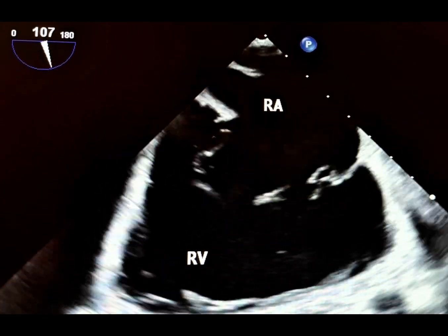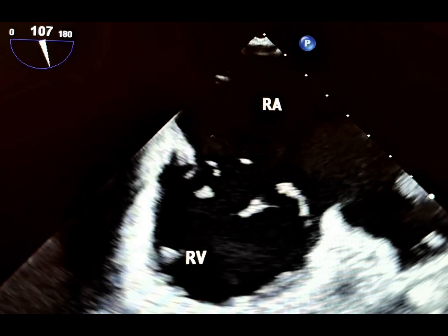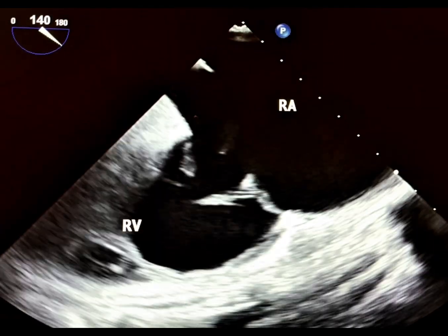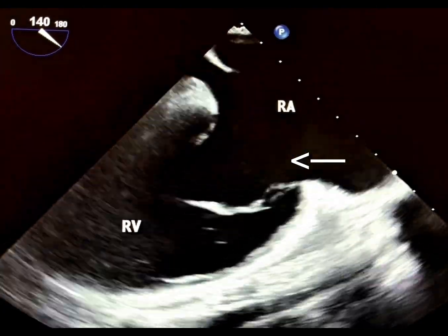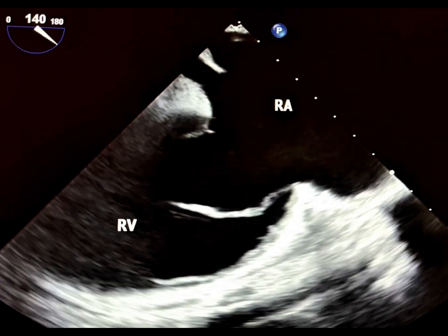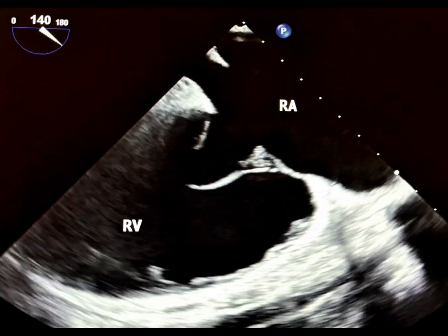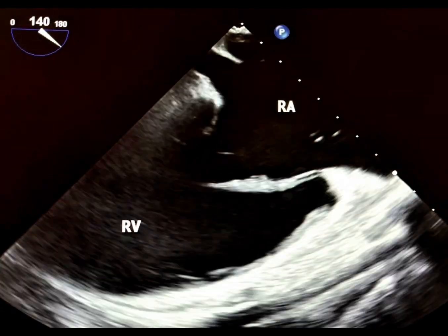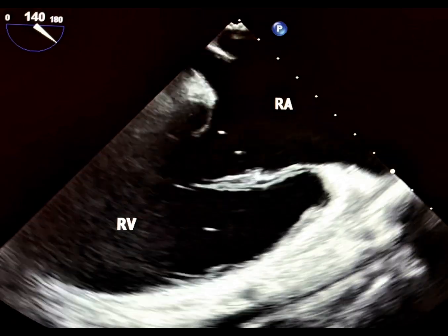This is a situation intolerable for the tricuspid valve apparatus. As this view shows, the anterior tricuspid valve leaflet is flailed. However, acute post-traumatic tricuspid regurgitation is often overshadowed by concomitant injuries, leading to delayed presentation with RV failure symptoms.